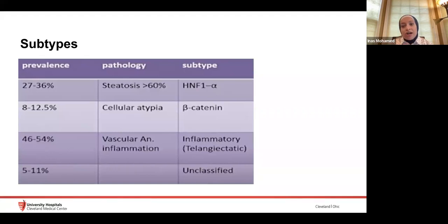There are differentials, such as a very well-defined HCC that still has some normal-appearing hepatocytes, but just for the basics, the only lesion that retains the contrast in the hepatobiliary phase is focal nodular hyperplasia. Simply put, that's it. I have another slide for EOVIST, and I'm going to talk about it a little more when we get to HCC, but that's it for now.